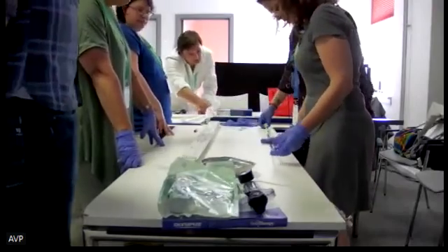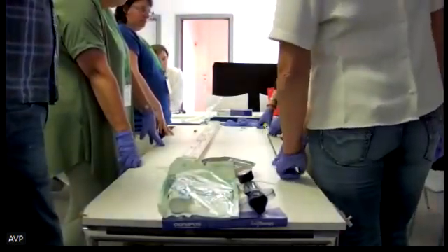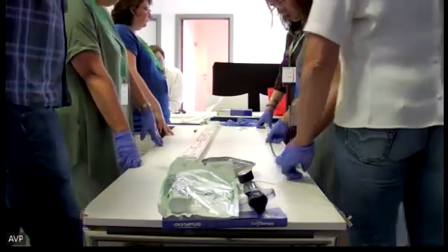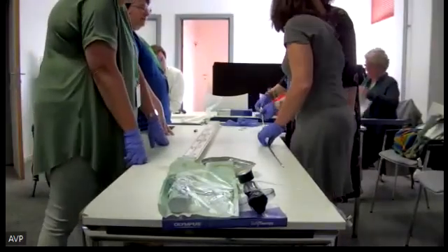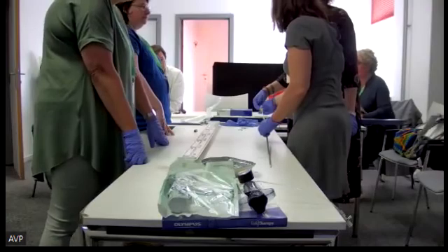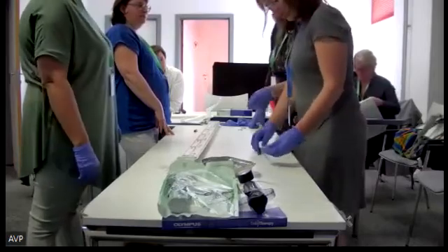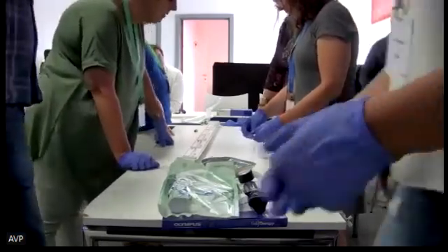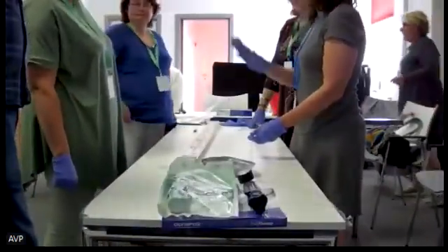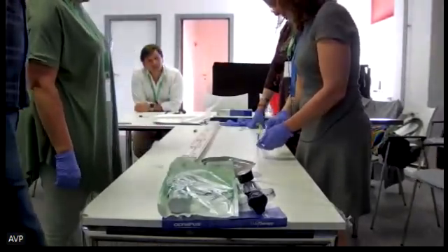So this is an enteral stent, but it's a bit the same kind of release that we did for the biliary. So we also put this on a guide wire, but a thick, a stiff guide wire, and once we are in place, here this is very important for the physician. You do this under X-ray, but you can also do it with endoscope control. So this is the end of the stent, and this yellow marker is like in the biliary stent, it's the same thing. You have the yellow marker there.